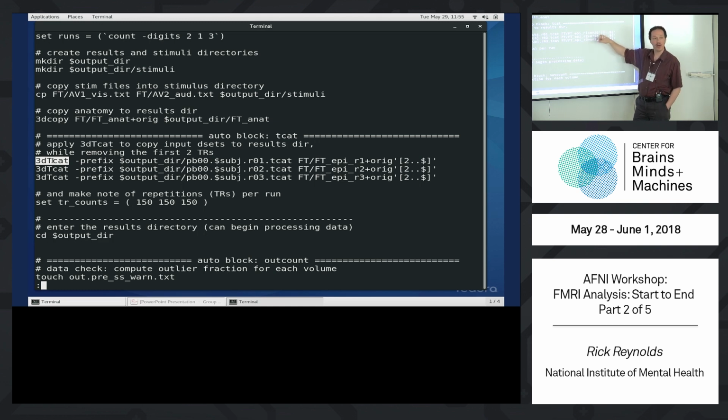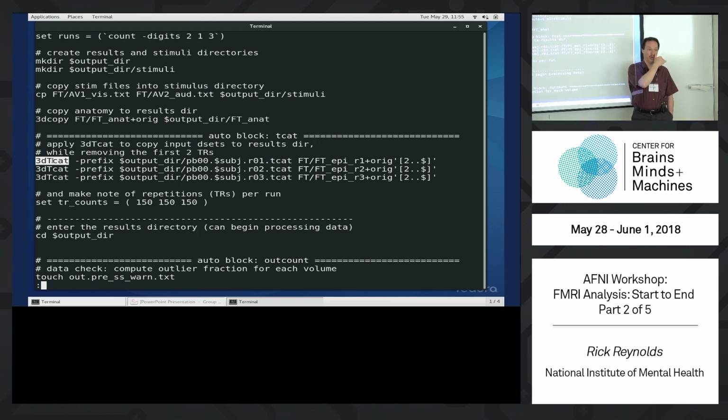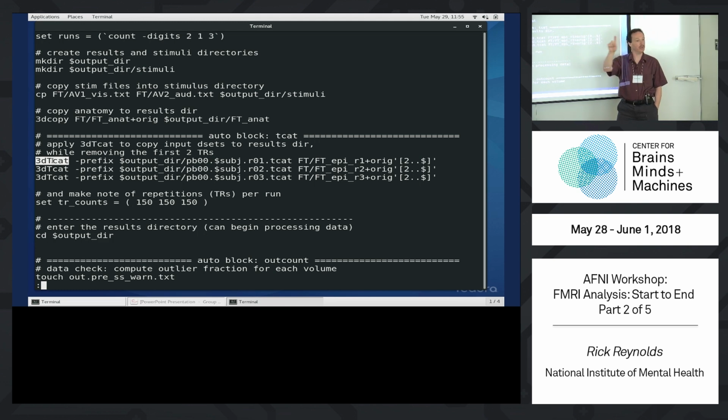Do we know what the brackets are used for by the shells? Those are wildcards. So if you want to match anything that has A, B, C, and then either D or E or F or G, you can put brackets D, E, F, G, and then whatever comes after it. And it will use that for a wildcard match, just like the asterisk or the question mark. Question mark matches exactly 1 character. Anyway, so those are wildcards.